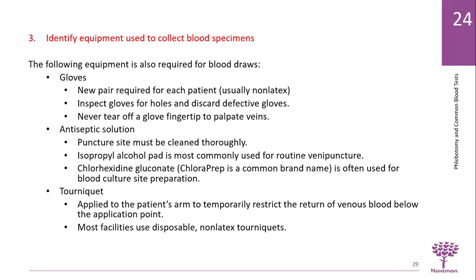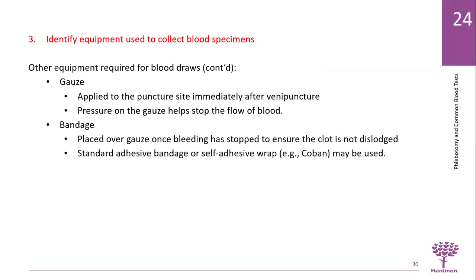So the following equipment is also required for blood draws: gloves, you're going to need antiseptic solution, a tourniquet, gauze, and bandage. And you saw that in your video.